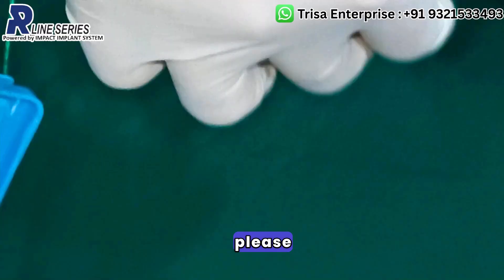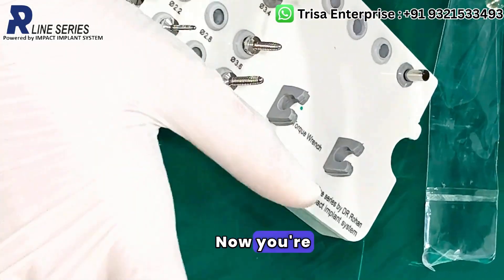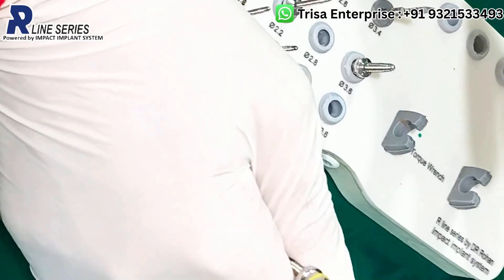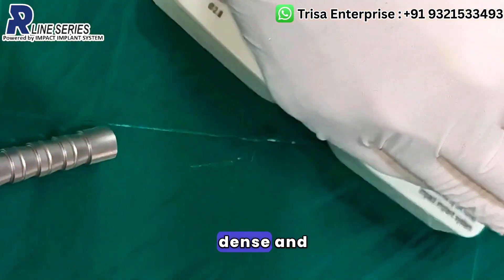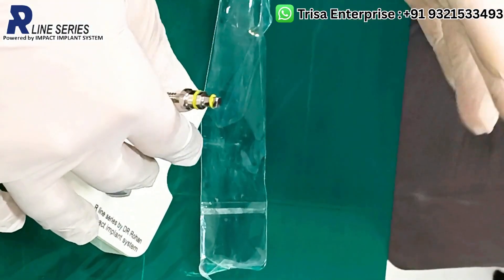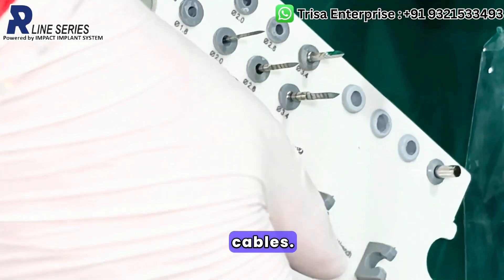Whenever in doubt, please use the bone expansion screw as a dummy implant. Once you have created the osteotomy and are unsure whether to drill more or not, pick up your 2.8mm or 3.3mm expansion screw and place it in your osteotomy. This will give you thorough judgment about the quality of the bone. If the bone is dense and you want to place an implant, you can drill more. If the bone is soft, don't drill more — remove the screw and place the implant. That covers the entire kit drilling protocol for BCS as well as KOS implants.